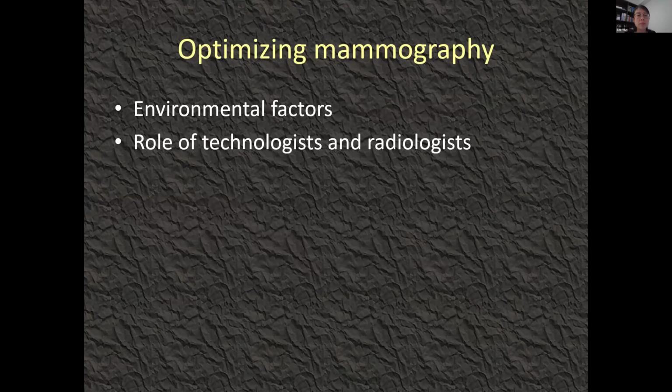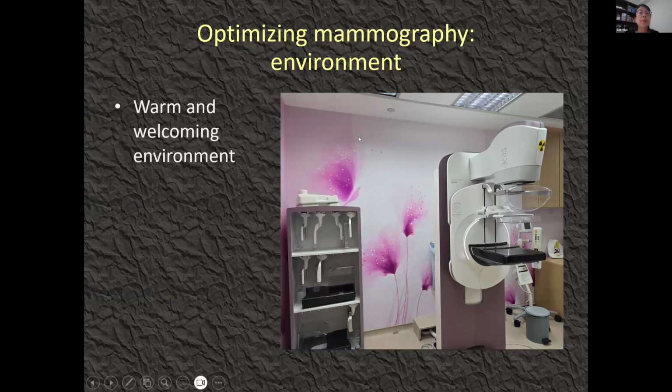So how do we optimize mammography? There are environmental factors and also the important role that technologists and radiologists play. So this is a photo that I just took of one of my mammography rooms in my department. You can see that the wallpaper has pink flowers and pink butterflies, and we hope to create a warm and welcoming environment for the patient so that she is more at ease.